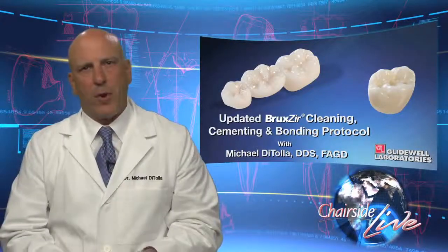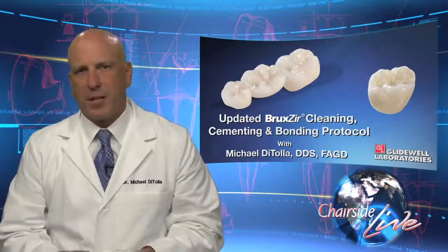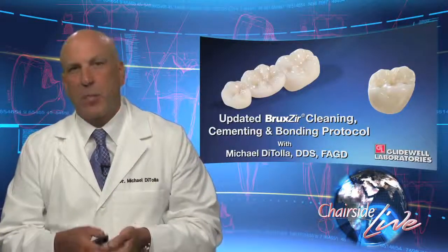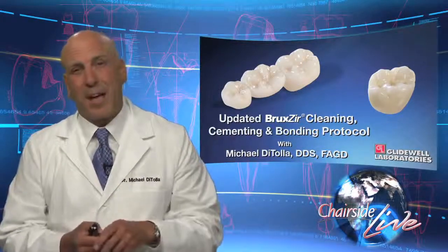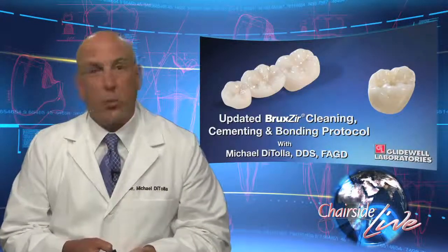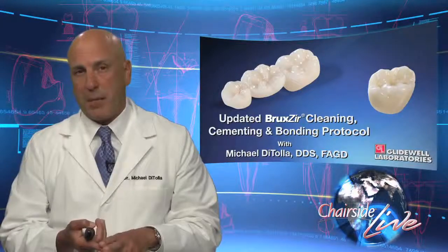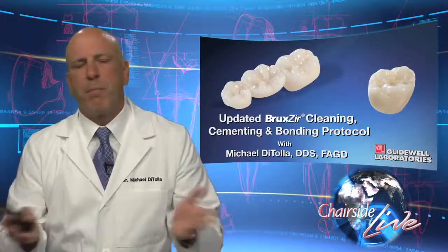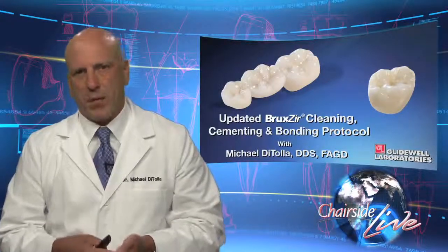Things change, however, when we get to BruxZir, because it's zirconium oxide. Everything that I'm going to say that applies to BruxZir because it's zirconium oxide also applies to the other zirconium oxide based crowns as well, whether it's Lava from 3M ESPE, Procera Zirconia, Zircon, or any of the many other zirconia based restorations out there.